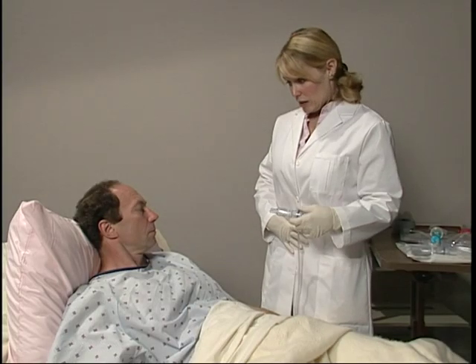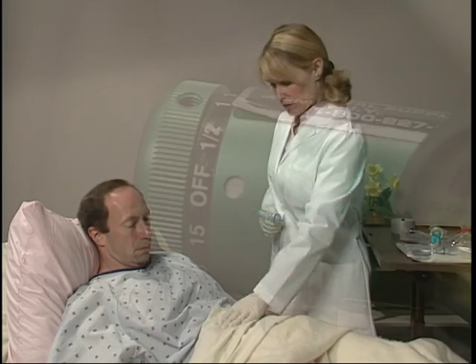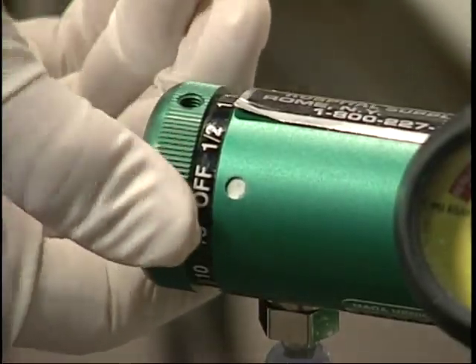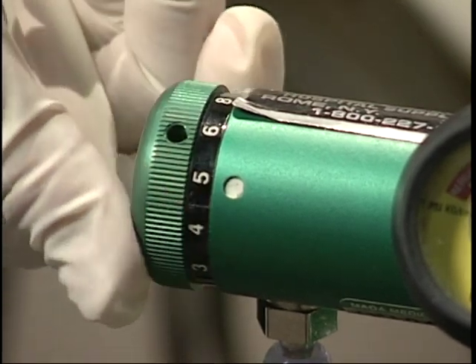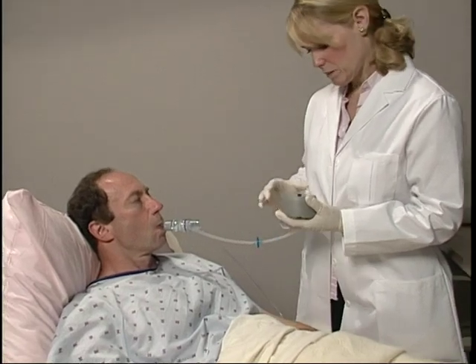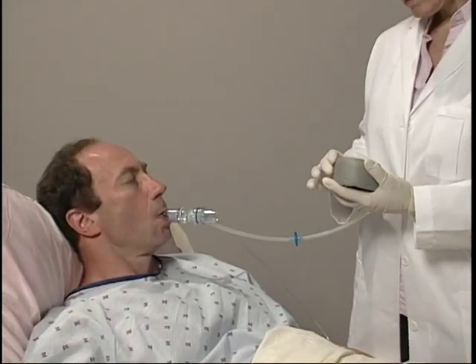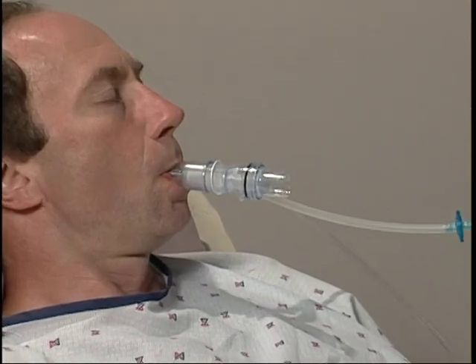To begin, instruct the patient to relax while performing diaphragmatic breathing. Set the flow rate to 5 liters per minute on the wall air or oxygen flow meter. Place the mouthpiece in the patient's mouth and instruct the patient to breathe easily against the pressure from the device. Be sure that the patient maintains a tight seal on the mouthpiece during therapy. Recommend the use of a nose clip if necessary.